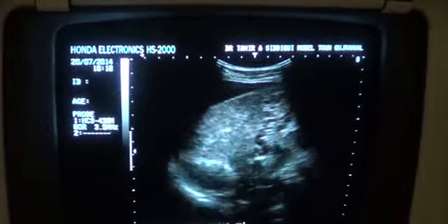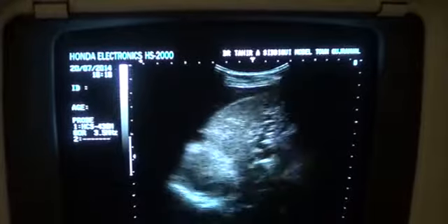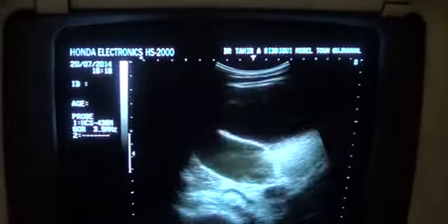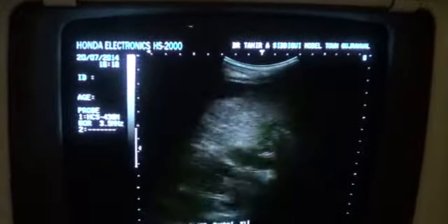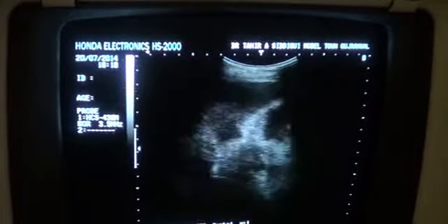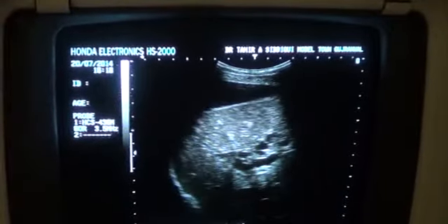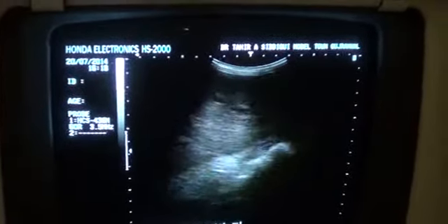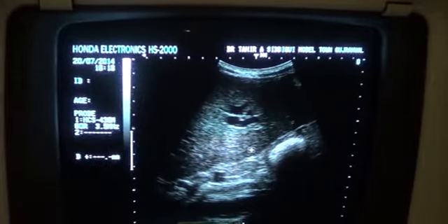Anyway, this is a cirrhotic liver with dilated intrahepatic bile ducts surrounded by fluid, and a distended gallbladder, CBD not clearly visualized. You see the relatively normal dimensions of the right lobe and the large left lobe of the liver, which extends beyond the region of the superior mesenteric artery from the aorta.